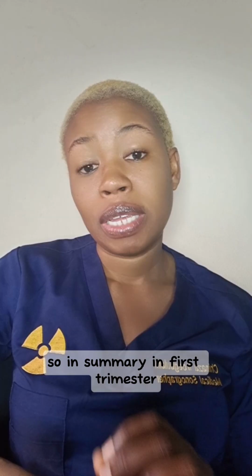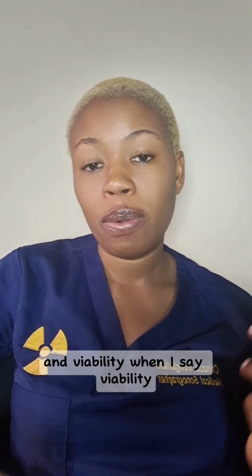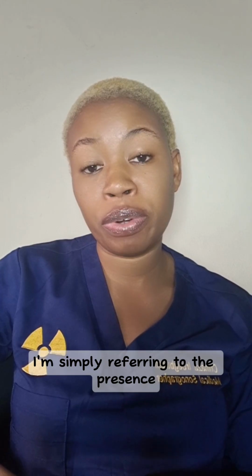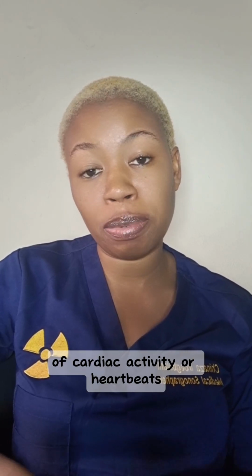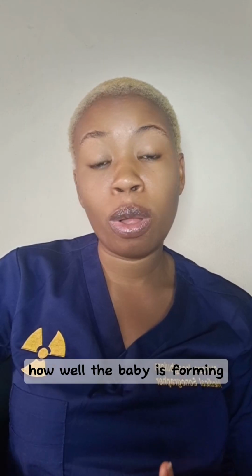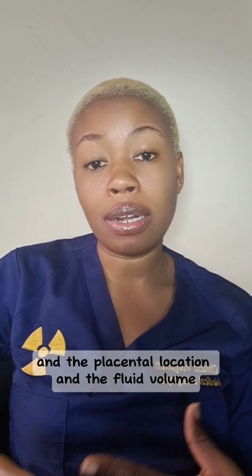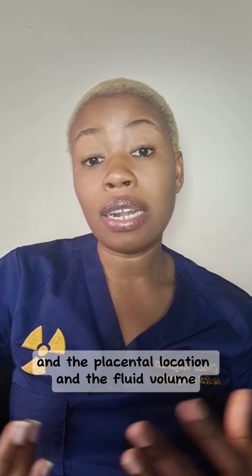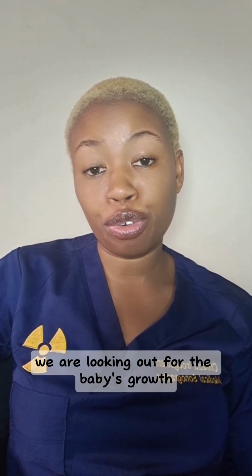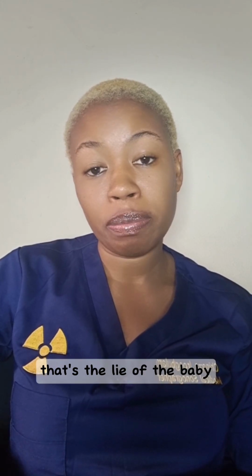So in summary, in first trimester, we are looking out for the baby's location and viability. When I say viability, I'm simply referring to the presence of cardiac activity or heartbeats. In second trimester, we are looking out for structural development, how well the baby is forming, if there are any congenital abnormalities, and the placenta location and the fluid volume. In third trimester, we are looking out for the baby's growth, the weight, and the delivery planning. That's the lie of the baby.